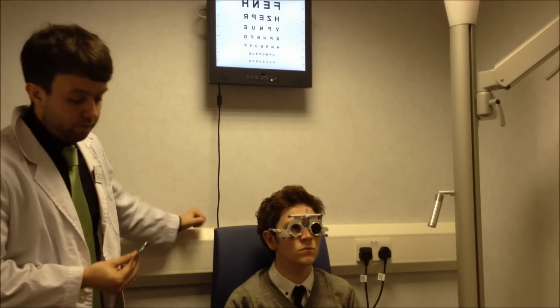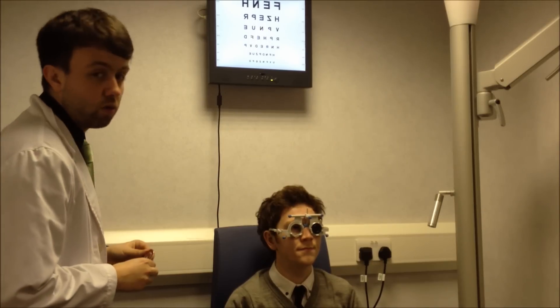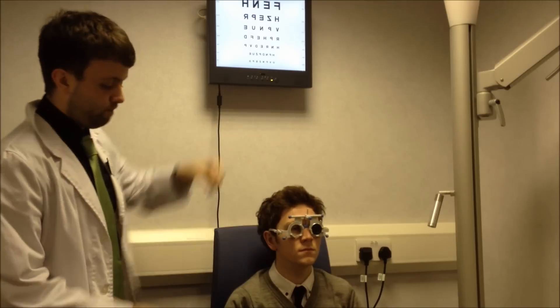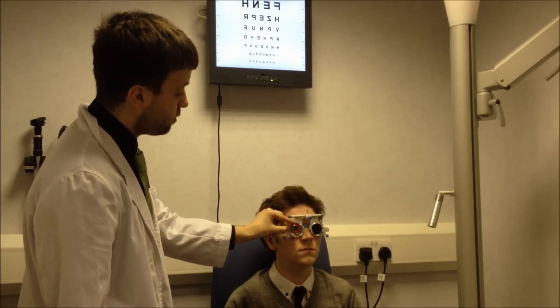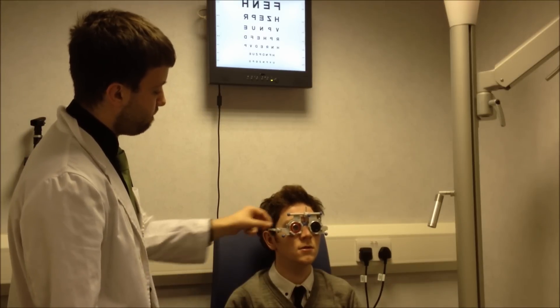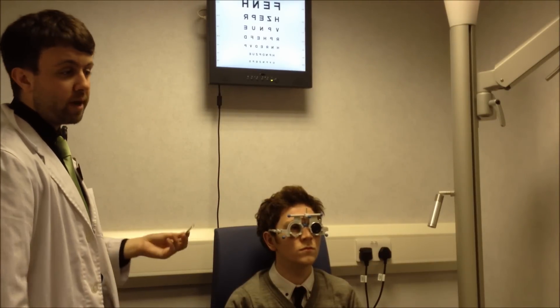We're going to do the over-refraction just with plus 0.25 and minus 0.25 lenses, so we'll do the plus 0.25 first. Sean, can you just look at that H there for me? I'd like you to tell me if this lens, when I put it in front of your eye, makes your vision any worse. Slightly worse? Right, okay. So it's not wanting any more plus, so now we'll do the same with minus.